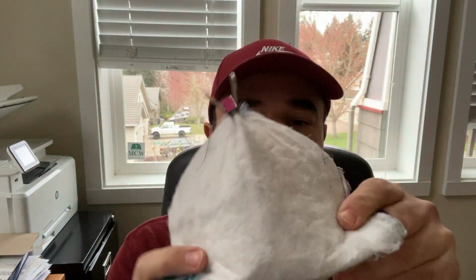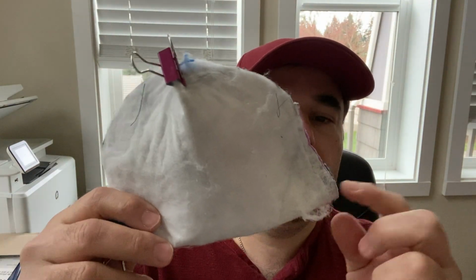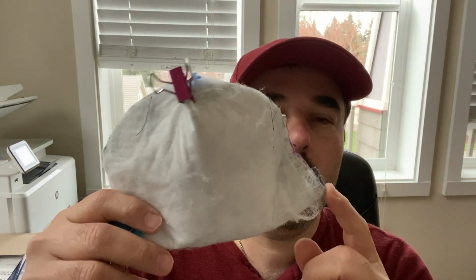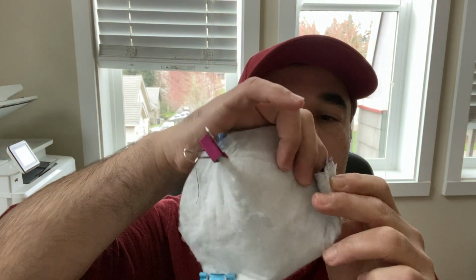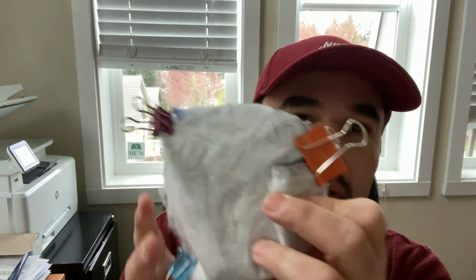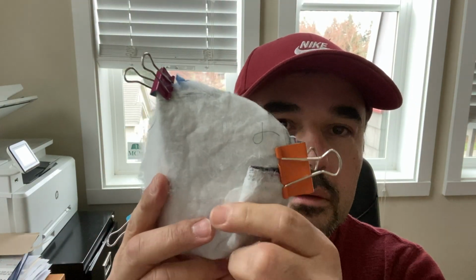All right, and what I want you to do is, starting on one of these corners, take off the clip, and I want you to bend this triangle inward. I'm sorry, bend this corner inward so that it looks something like this. And again, kind of mold it in there. And then put your clip on again. So you can see how that's looking. And you'll do the same thing on this side.